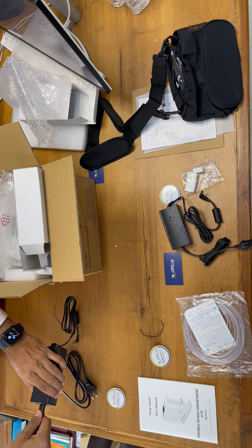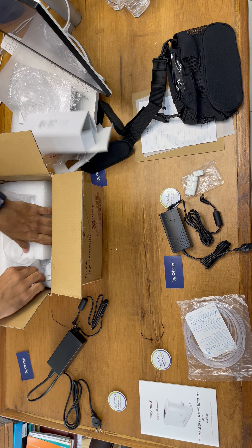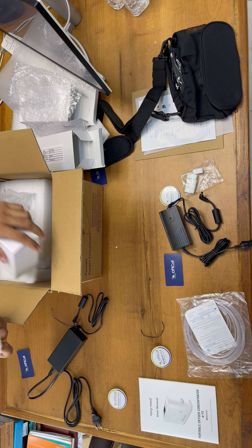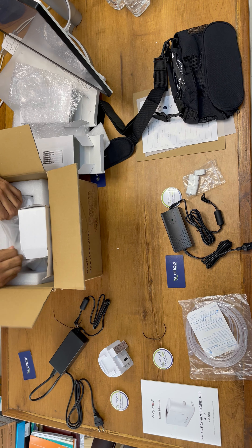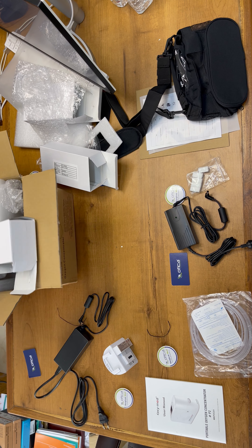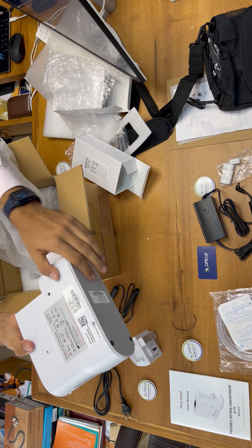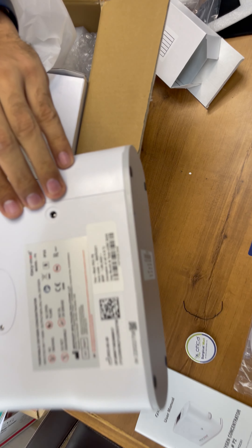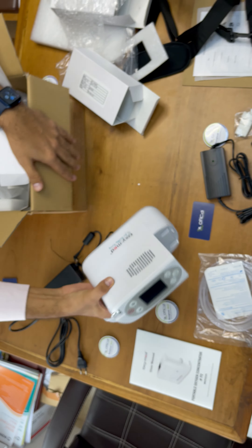Now the charger is ready. The company has provided us with the battery separately along with the machine — this is the detachable battery, as you can see. Now we are going to bring the main unit. This is a very portable and tiny machine. OxyMed P2 model portable oxygen concentrator — this is the main device.